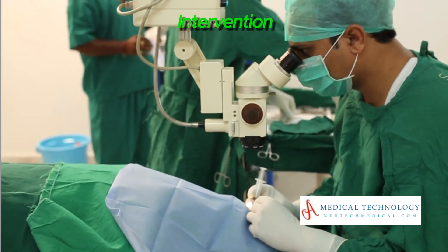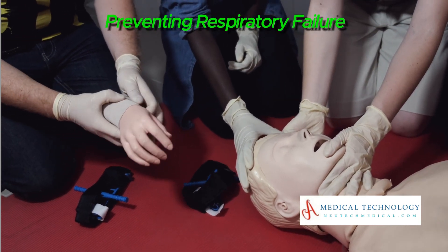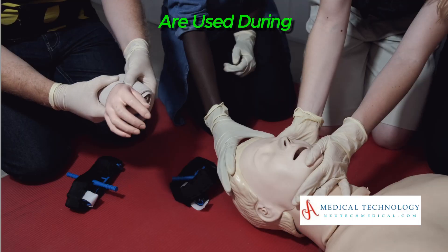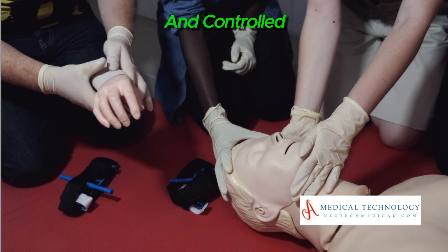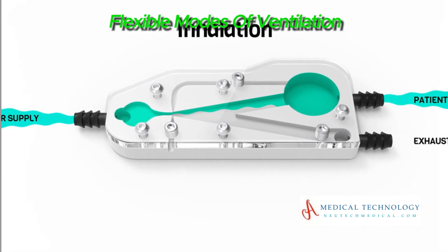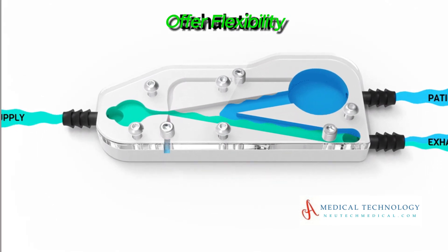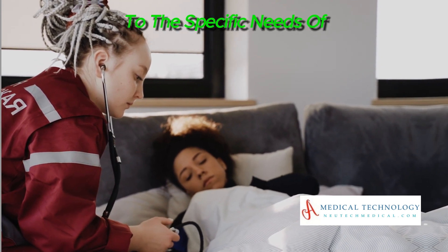In critical care settings, ventilators can be a life-saving intervention, preventing respiratory failure and maintaining oxygen supply to vital organs. During surgeries, ventilators deliver controlled anesthesia, ensuring the patient remains in a stable respiratory state under general anesthesia. Different modes of ventilation, such as volume controlled or pressure controlled, offer flexibility to tailor respiratory support to individual patients.